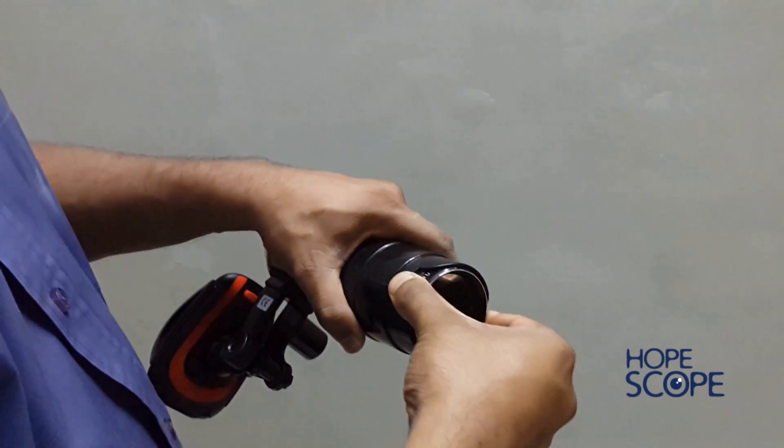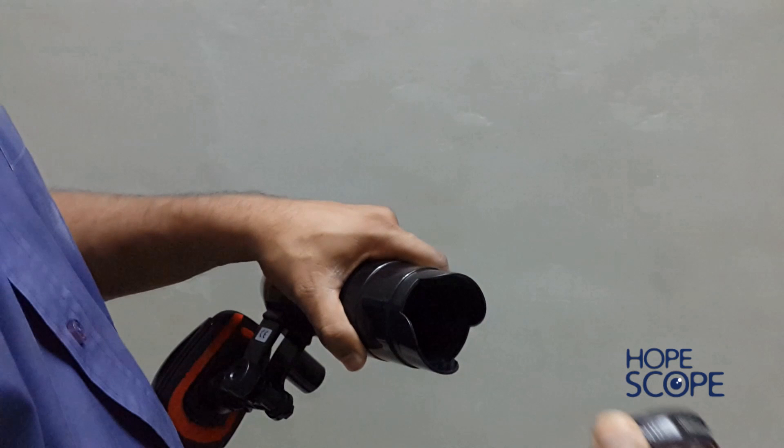The 20 diopter lens can be removed from the lens holder with a gentle side-to-side rocking motion.